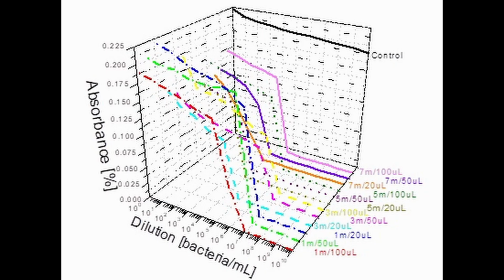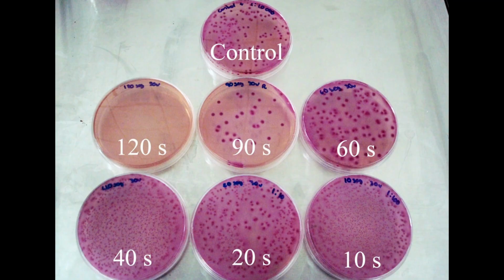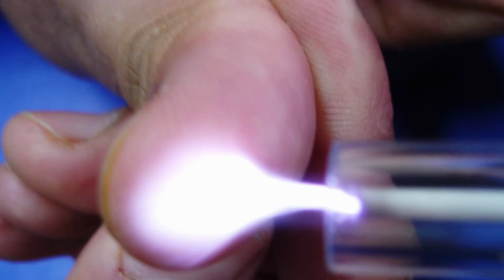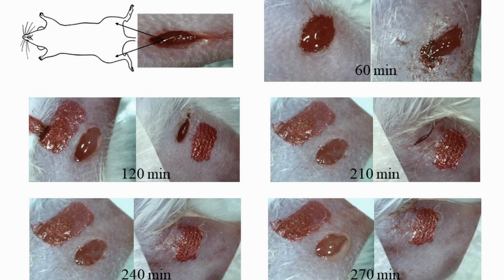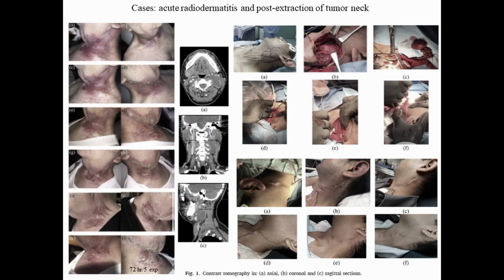It has been proved by several experiments that LTP deactivates numerous strains of bacteria or bacterial spores, noting more than one inactivation mechanism attributed to the excitation of biological cells. The microorganism deactivation capability of LTP provides a bactericidal effect for decontamination of material surfaces. Moreover, LTP is able to interact with mammalian cells and tissues in a non-destructive manner. It increases fibroblast availability and mobility, and accelerates wound healing, as practiced in vivo with mice, among other medical aspects.